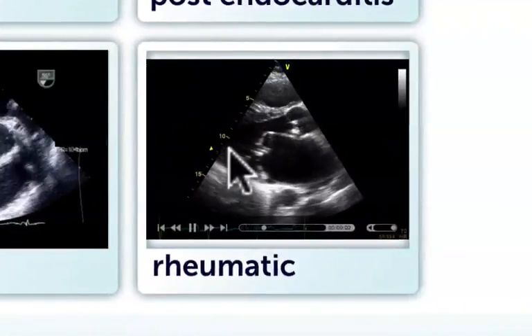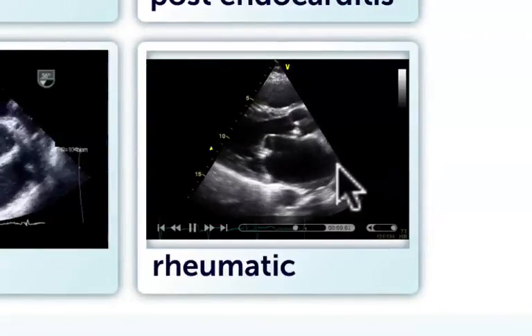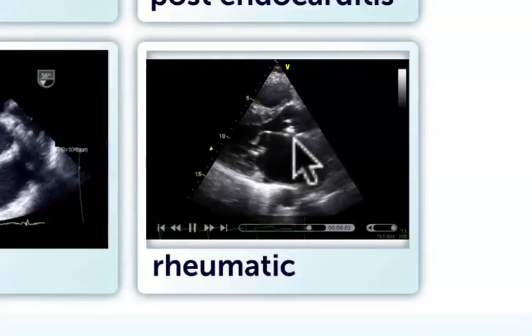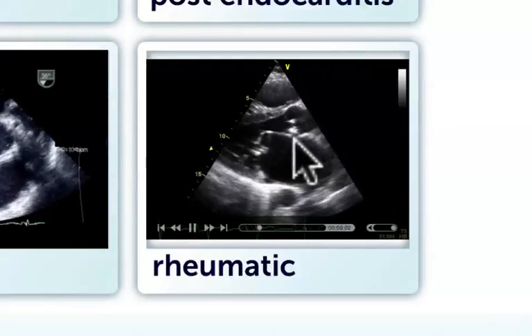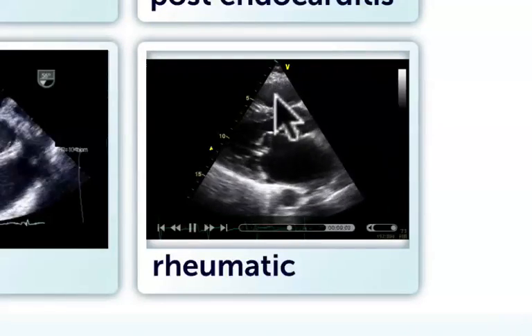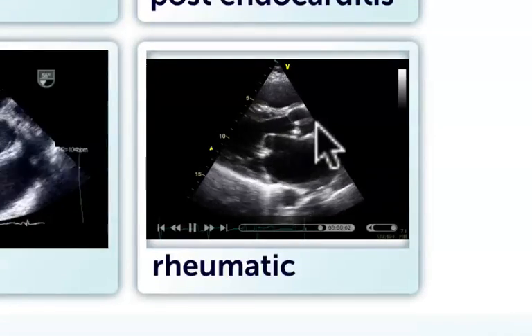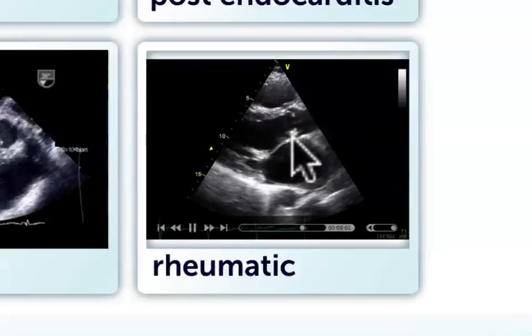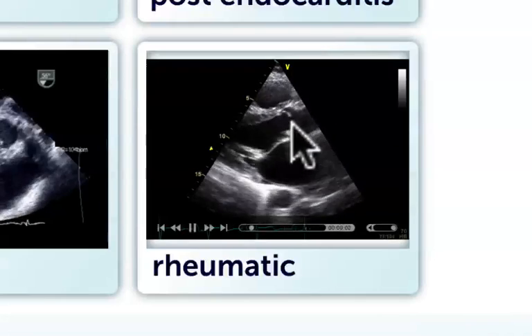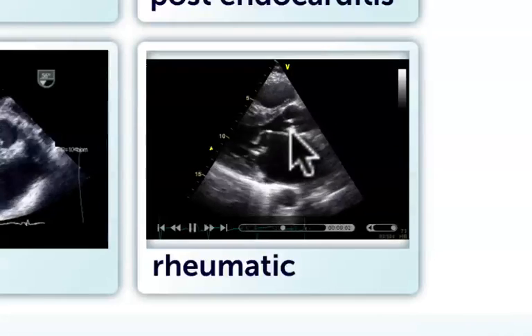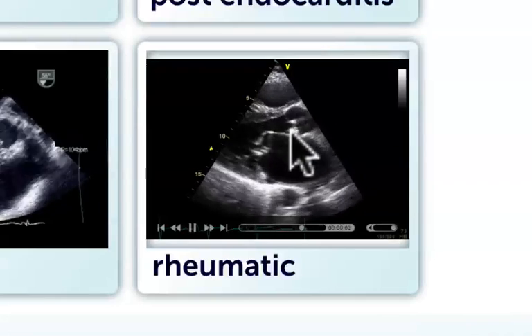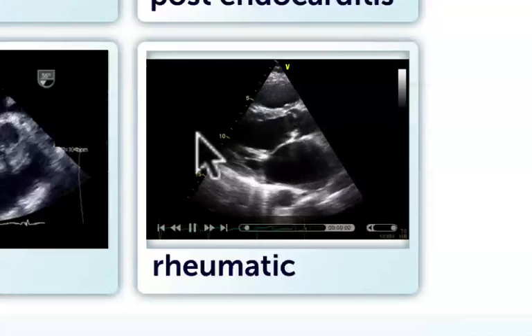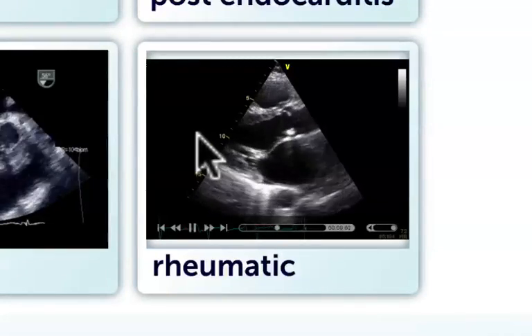And here on the bottom, a patient with rheumatic heart disease who has mitral stenosis, where the rheumatic heart disease also affected the aortic valve, thereby causing some degree of doming and thickening, and this leads to aortic regurgitation as well.